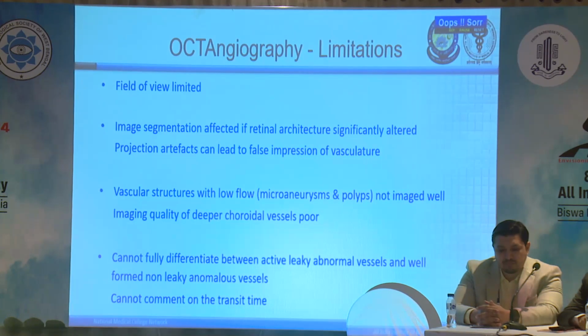Coming to the limitations, that is my last slide. You have certain limitations of OCT angiography: the field of view may be limited, although we are coming up with wider ultra-wide field scans also, but they are affected by motion artifacts and other artifacts. You have the segmentation and the projection artifacts that may impede the quality of your scans.